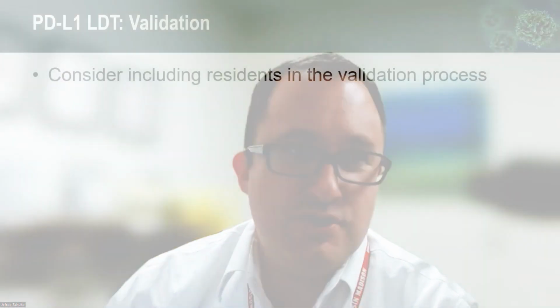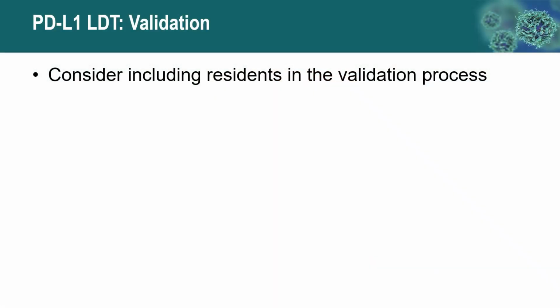Another thing that I've been trying to implement is bringing residents into the validation process. We did have a resident help us with the last validation we did for PD-L1 in GYN specimens. And I think that resident found that was a useful experience. It is a challenge for residents, fellows, and also practicing pathologists.